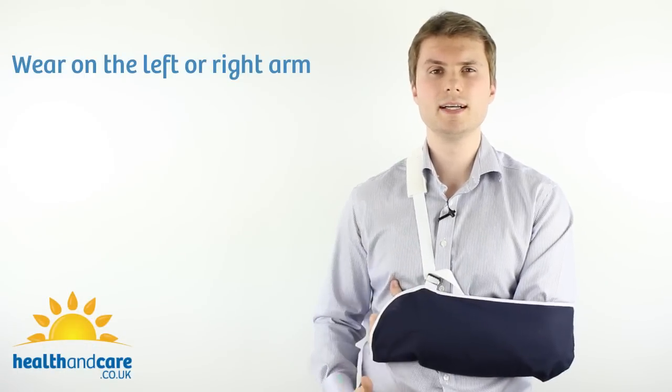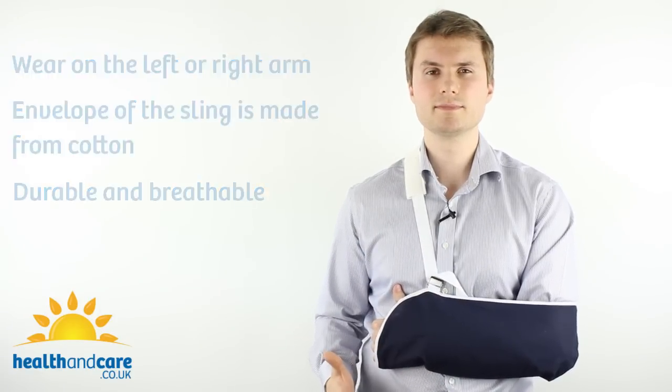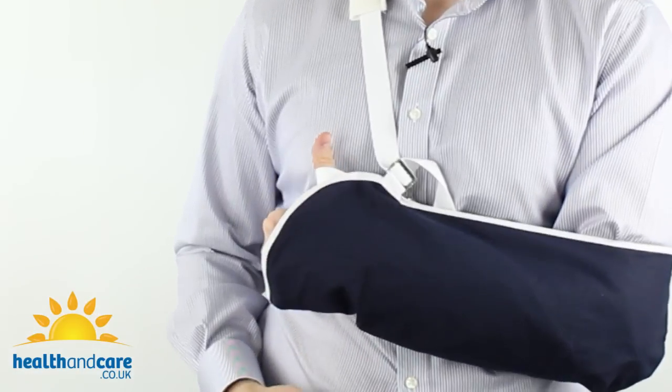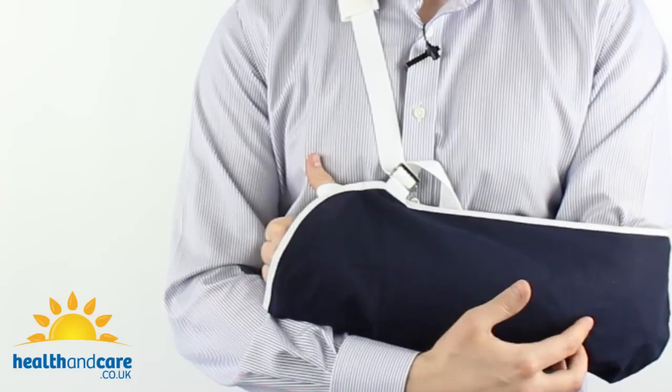The Cotton Arm Sling can be worn on both the left or the right arm. The envelope of the sling is made from cotton, so it's highly durable and breathable. The sling also has a thumb loop which stops the sling from migrating down the arm while you're wearing it and stops your arm from falling out, so you don't need to keep adjusting it during the day.